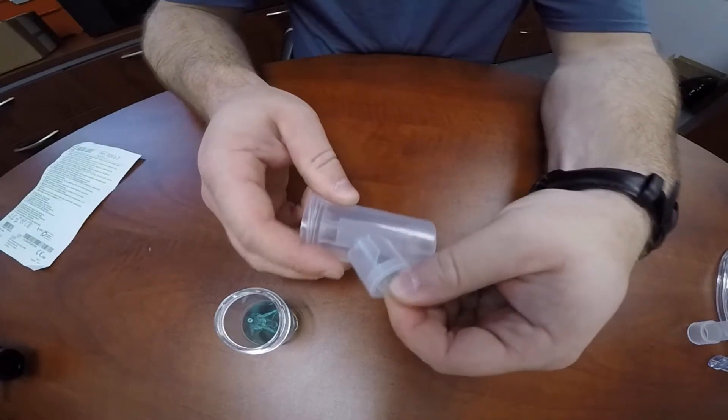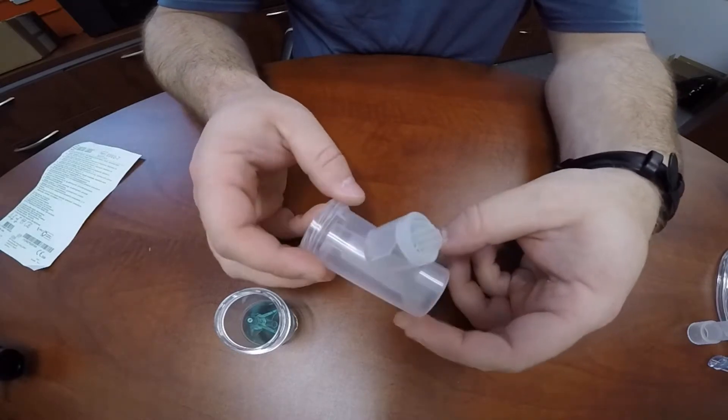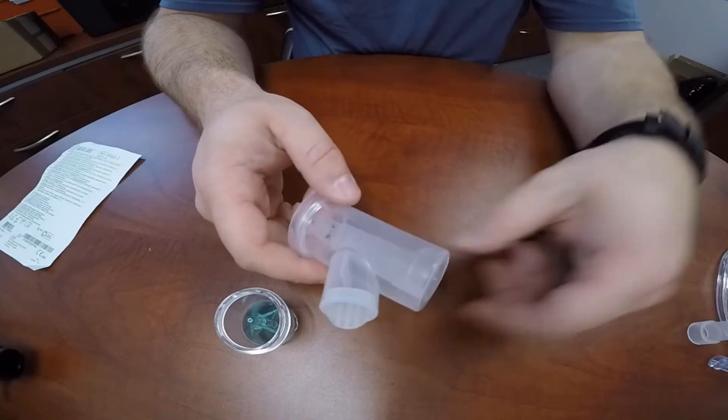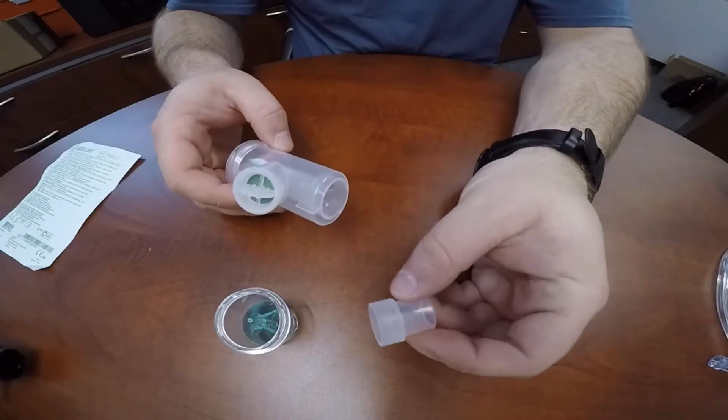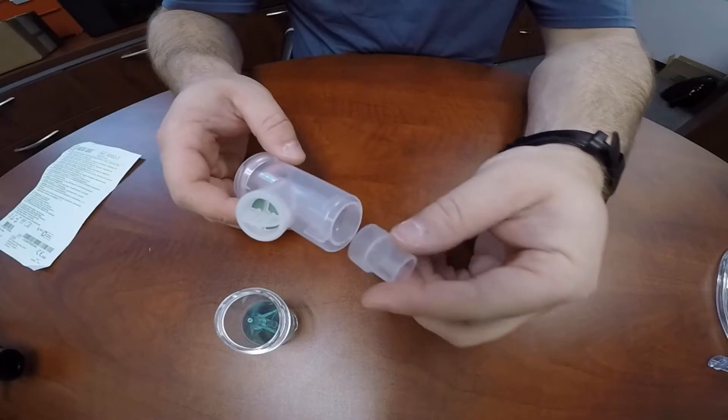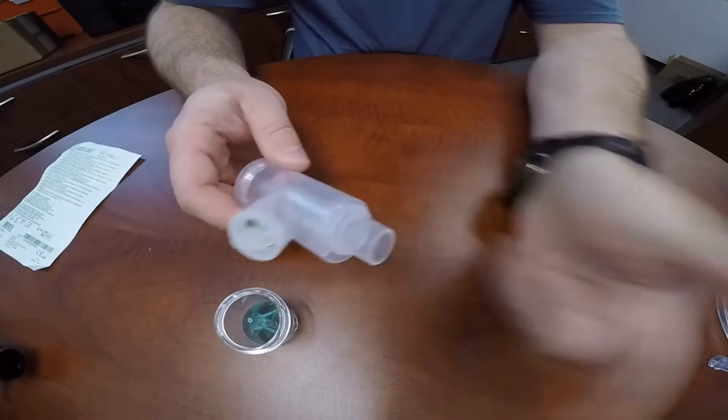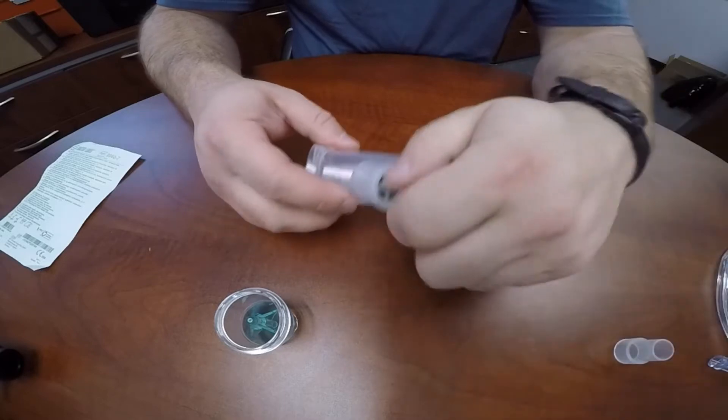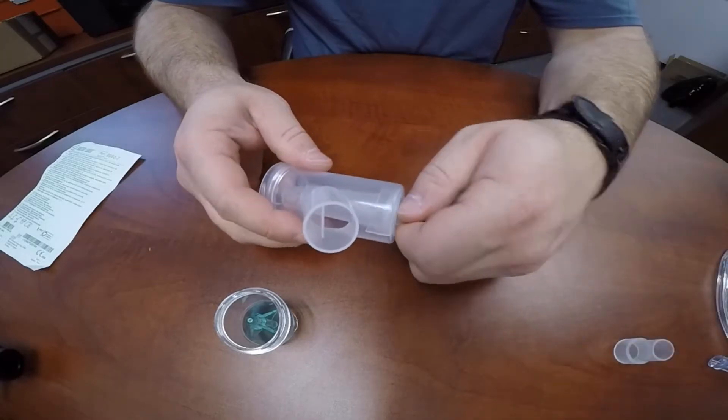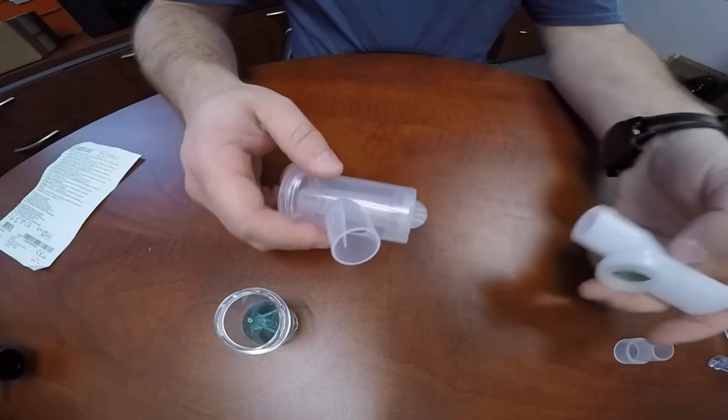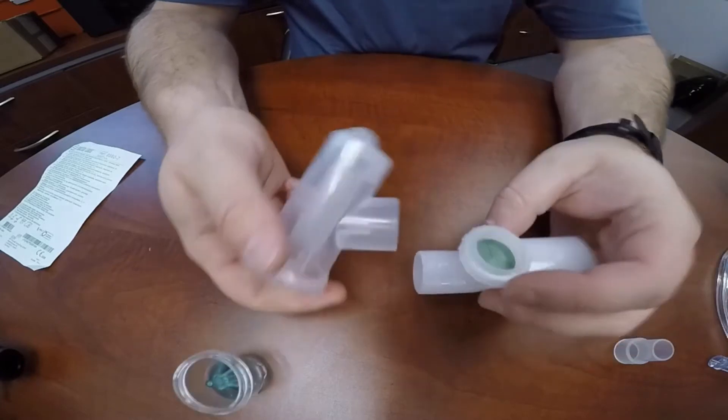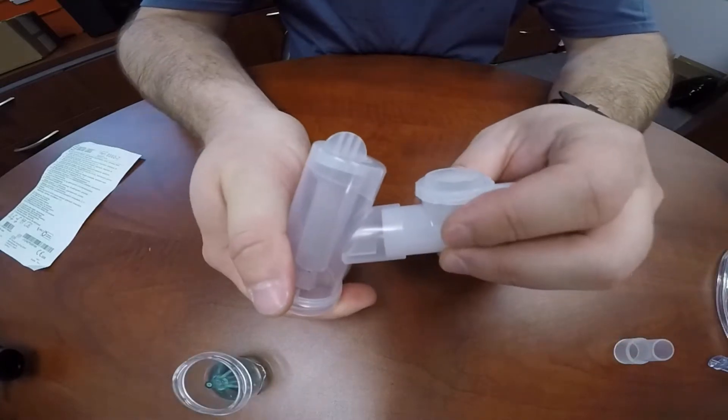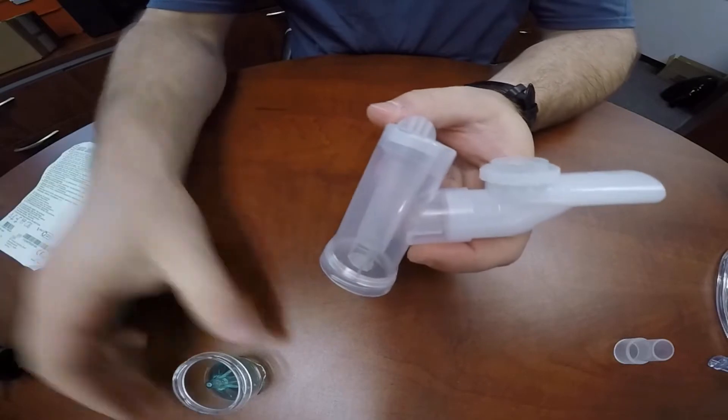The inhalation chamber can be moved from the top of the device to the mouthpiece port in order to use the mask adapter in order to attach this to a mask for patients that would require that. The inhalation chamber can be moved back and forth from the top of the device to the mouthpiece port.